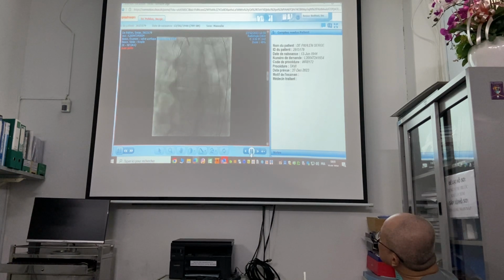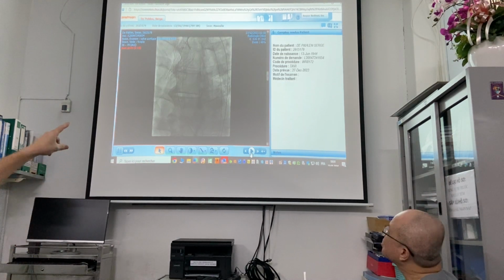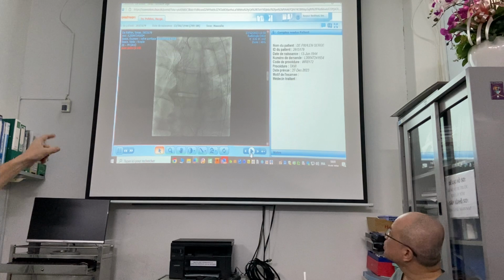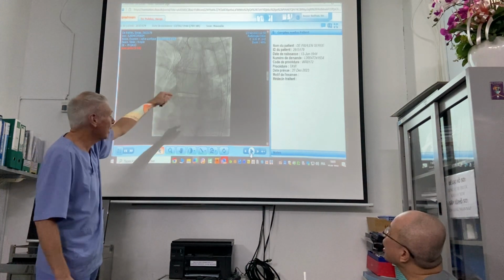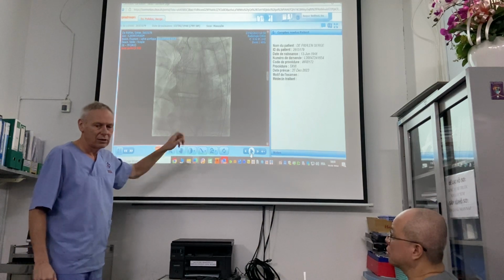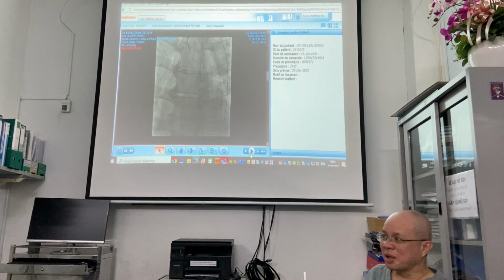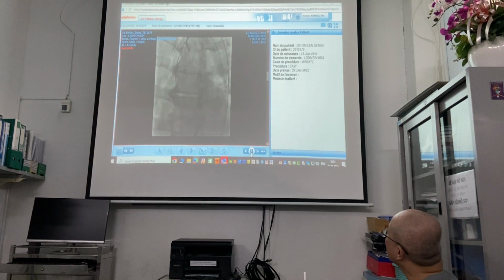And now the next step is, of course, we have to put a new valve. So the lady from Medtronic said, okay, because if now we try to put a 34 valve, this is very bulky, maybe I will have trouble to get through. So what you have to do is one person has to keep the snare and the other person has to put the second valve over the wire through the first valve, which is quite tricky. So the lady from Medtronic said, use the Edwards valve. So we use the Edwards valve, and you will see that soon.